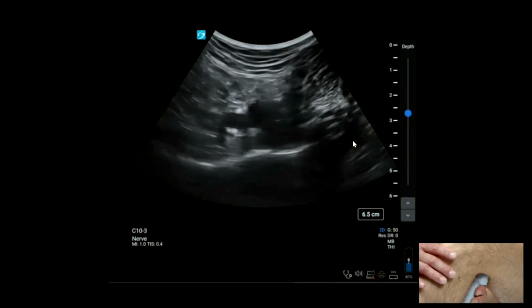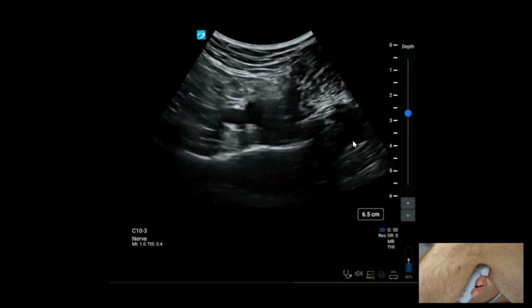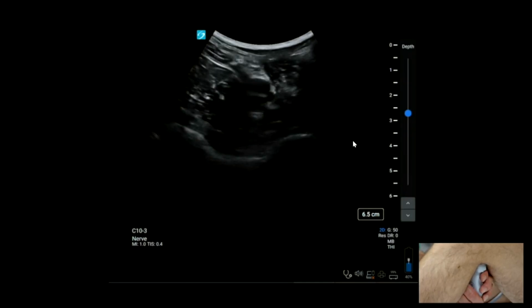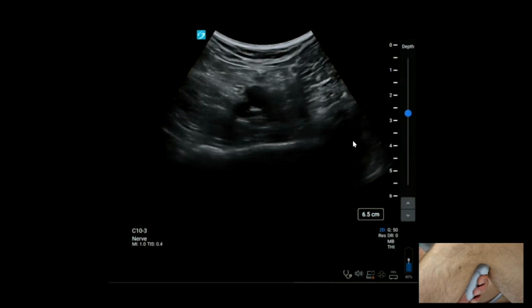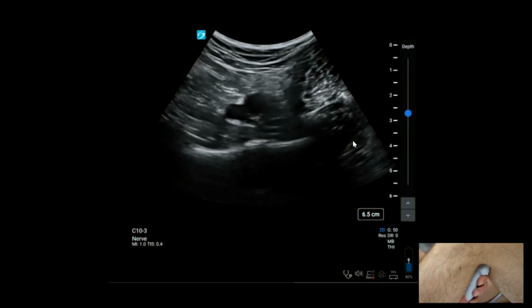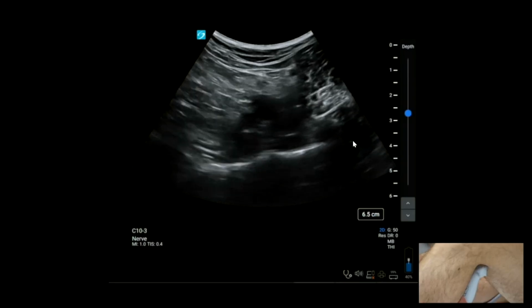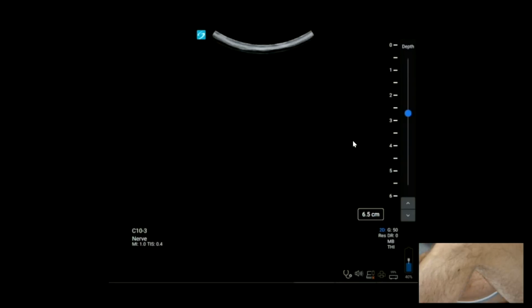So we're just a bit further down from where we would do a popliteal sciatic nerve block, and it's just about tilting your probe, really. You can't really go wrong. You're just going to look for that view of the condyles coming into view and then flattening off. So you're quite distal in the knee, probably about 2 or 3 centimeters more distal to where you'd start to do a popliteal sciatic nerve block. Great.